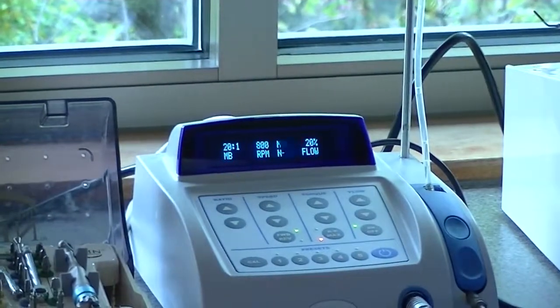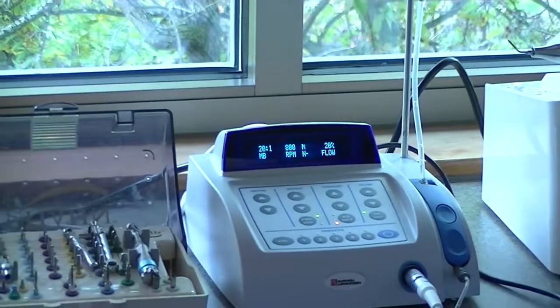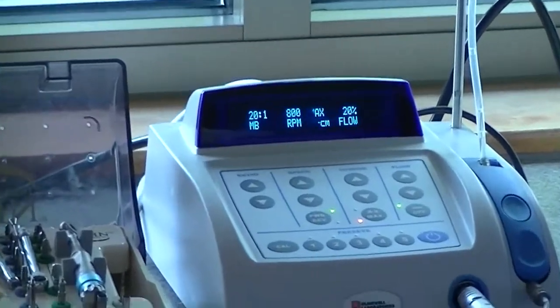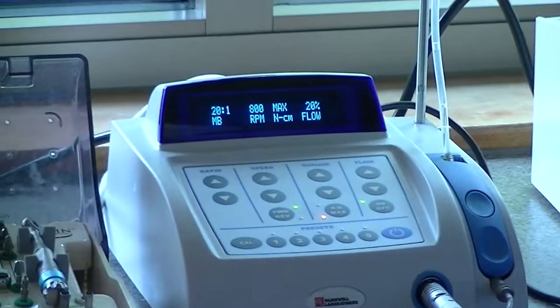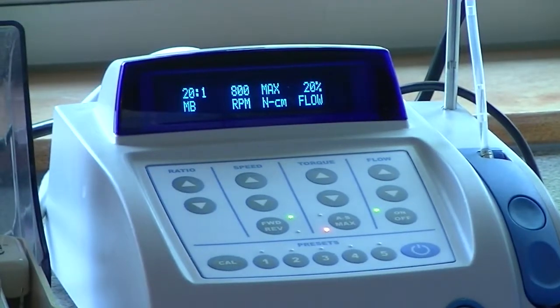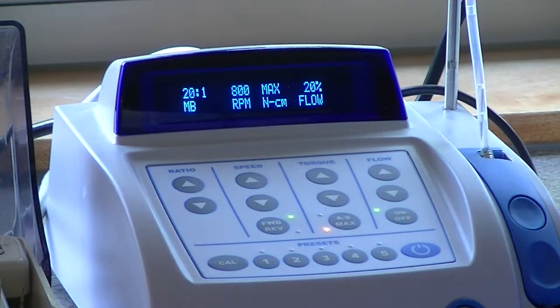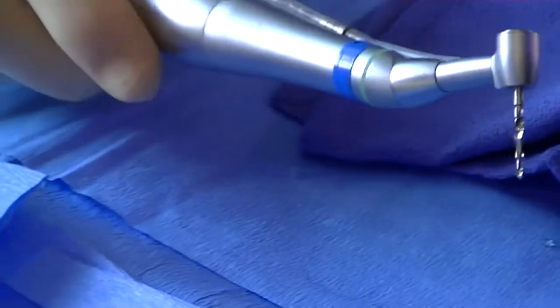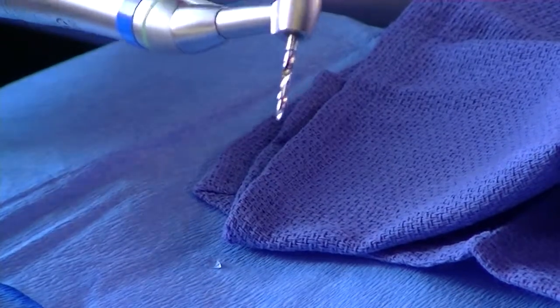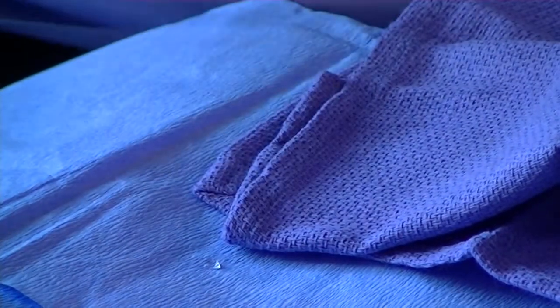And my favorite motor is the Aseptico motor from Glidewell. And you can see I like to go about 800 RPMs. I'm not so concerned about Newton centimeters at this position. As we've gone through before, we are going to take our 2.4 pilot burr, and I'm going to make my initial penetration through the cortical plate. We're looking at mesial, distal, buccal, lingual dimensions.